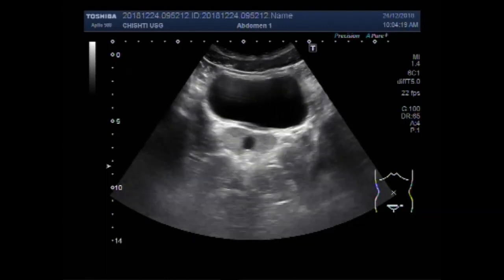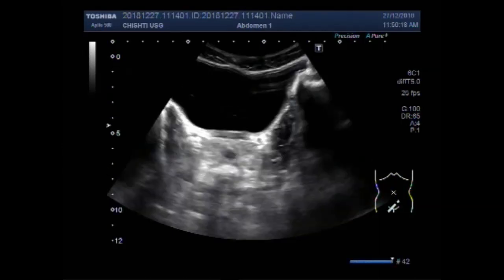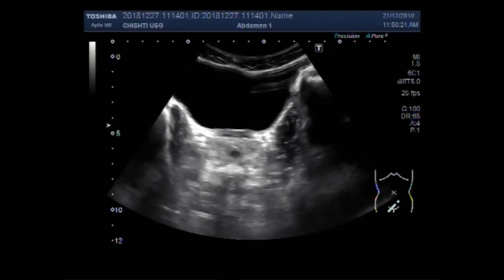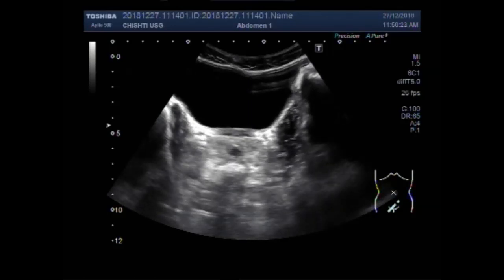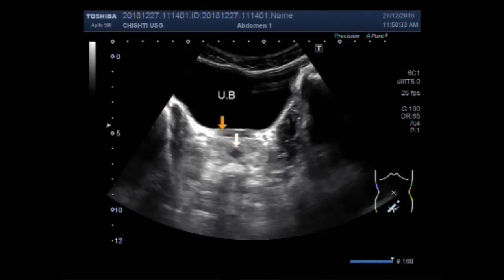Now you can see another case of a Prostatic Utricle Cyst. This is the Urinary Bladder and this is the cyst in the Prostate Gland.